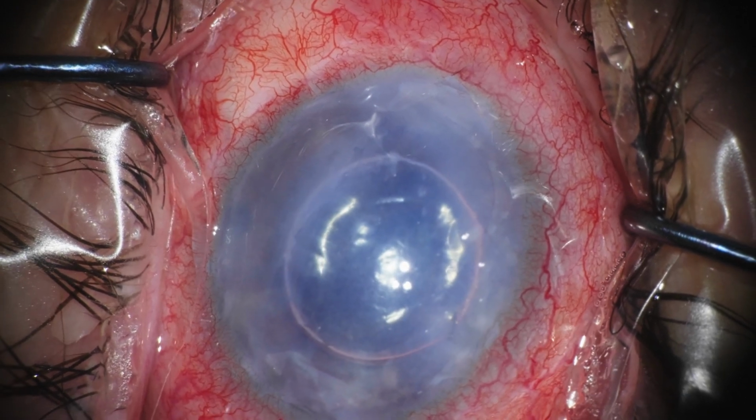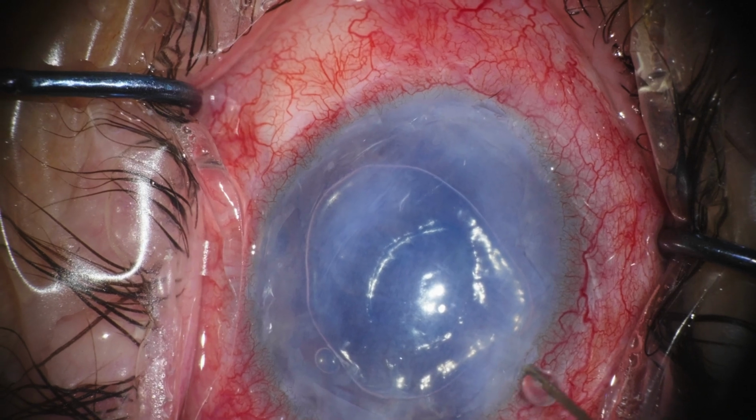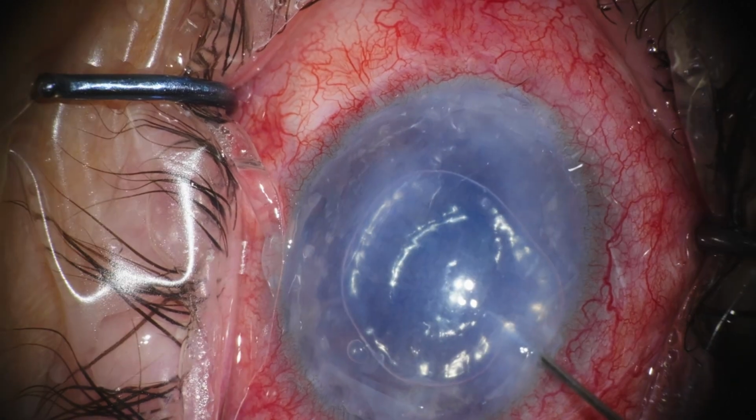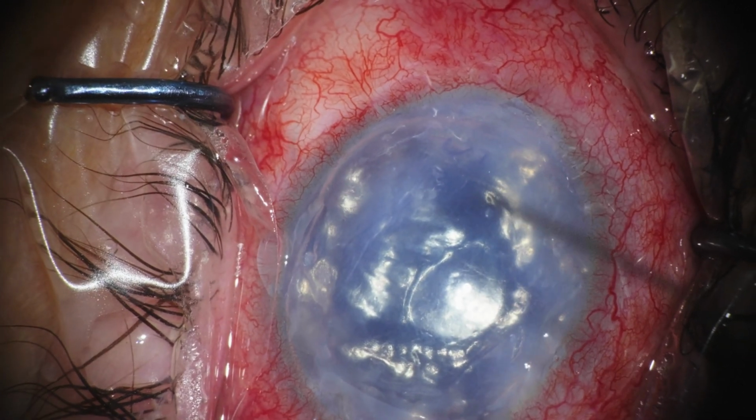Now we've injected an air bubble again, and we're using aqueous currents to unfold the edges that we ourselves have created in the process of dragging the graft upwards to 12 o'clock. But at this point in surgery, we're not very convinced that we can improve our view any further, and as time moves on, the stain phase... We're about 30 minutes in during the unfolding process, and if we don't get proper positioning and unfolding at this time, the view is only going to get worse because of the edema and because of the loss of the trypan blue.